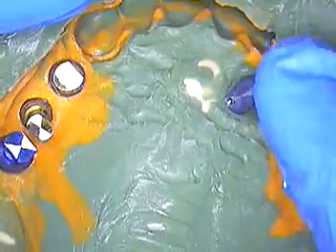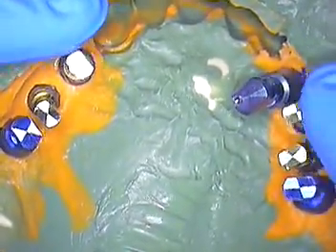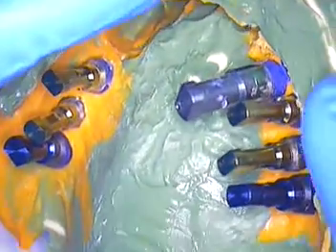This is the patient's right side and this is the left. I'm not going to go through my impression techniques, but I wanted to show you the setup. We do have emergence profiles all coincided with the impression, using customized impression copings that I made.